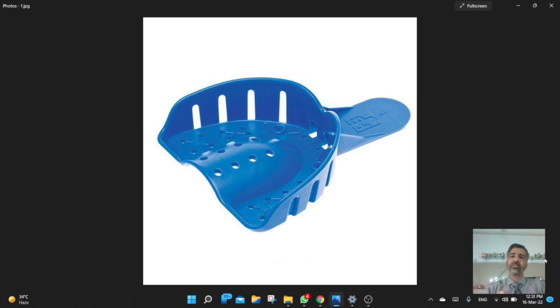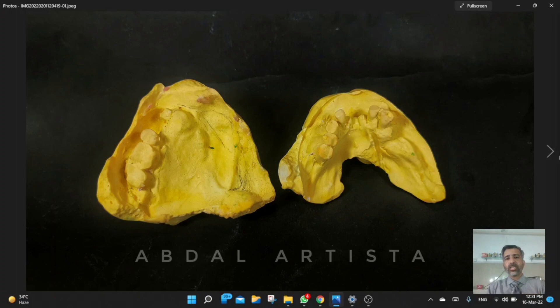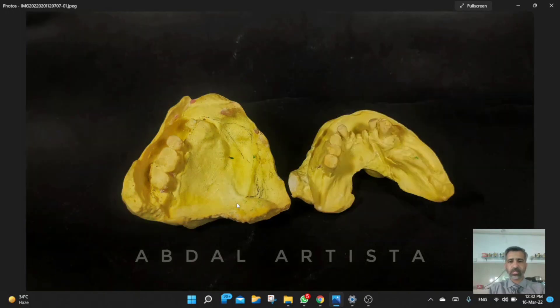The sectional impression technique means taking the impression in two steps. These are the first models. In this technique we recorded the dentate part first — the right side of the arch which had the teeth. Using this technique we properly recorded this dentate part, while for the defect area we needed another modified impression tray to record that region as well.